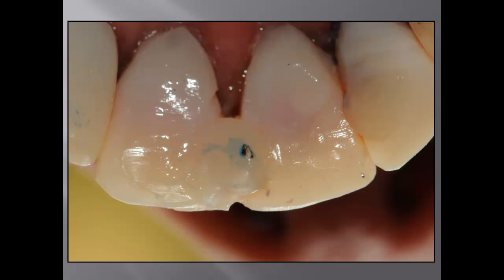So what I've been doing next is, on the crowns on 8 and 9, I put a small composite, cure it, and ask the patient to close her mouth up and down so I establish a nice small contact between the upper and lower jaw. The rest of the teeth are going to be separated; only the front teeth are going to be in contact. I've been using the blue paper, which is 200 microns. Then I use the red paper, which is 20 microns, from Parkell, and I want to make sure that the blue spot and the red spot coincide with each other.